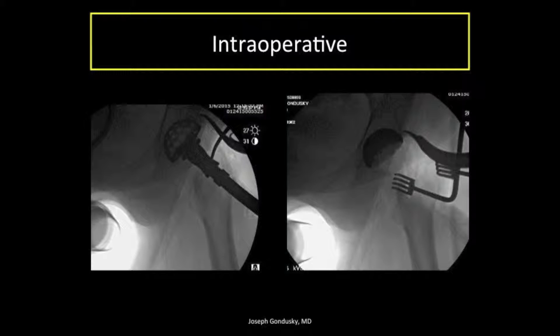Here are some fluoroscopy sequence shots — the final reamer in place and then the cup in place. I like to match the patient's native version and ensure that the anterior rim of the cup is covered so that they do not develop iliopsoas impingement, which is a real phenomenon and very uncomfortable for the patient without an easy solution. I like to feel my anterior and posterior acetabular rims and keep the cup confluent with those in order to match their version, being careful not to be fooled by osteophytes or wall deficiencies.